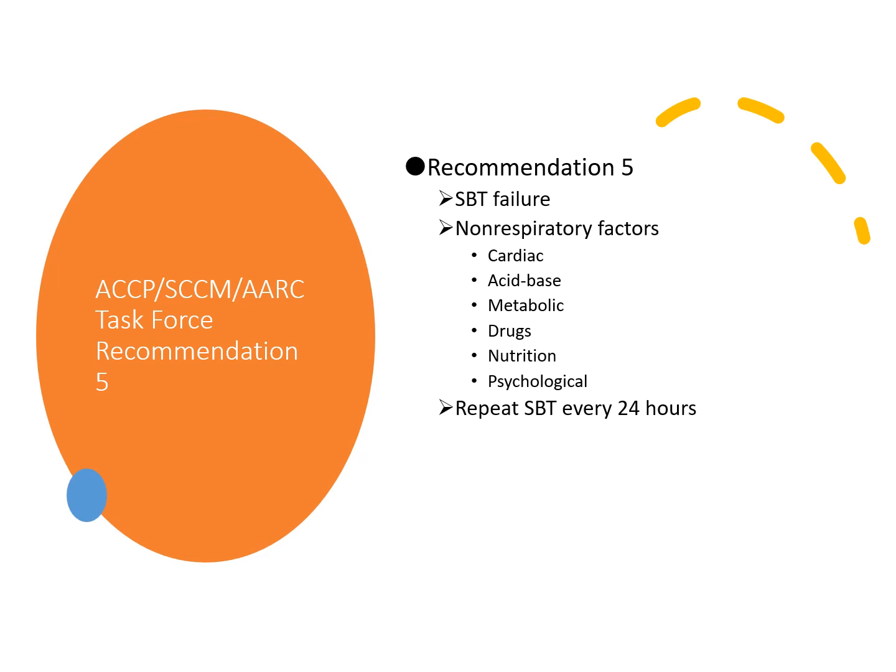Breathing on their own, they could go into that fatigue again, breathing through that tube just by themselves, right? And so that could actually delay them getting off the ventilator. So a failed spontaneous breathing trial really reflects persistent mechanical abnormalities of the respiratory system. So the respiratory system isn't quite healthy enough. So it's just not reversing quickly, so you're just going to have to take it slow, right? Just because it's going slow doesn't mean that it won't happen, right?